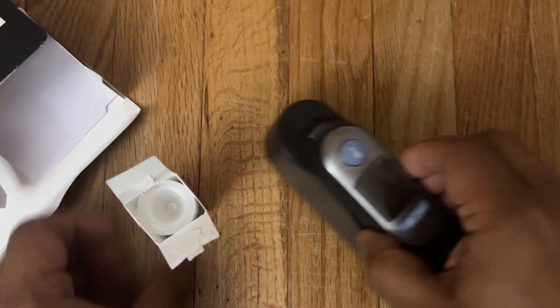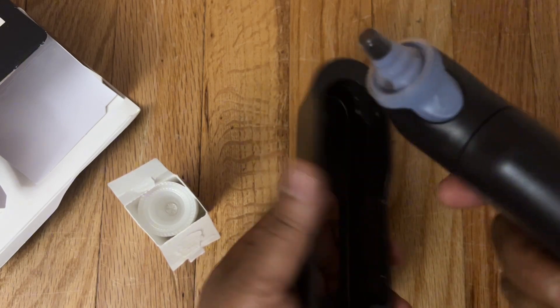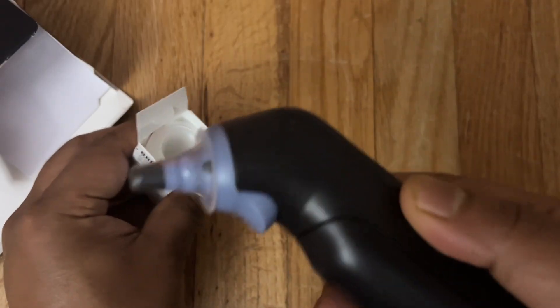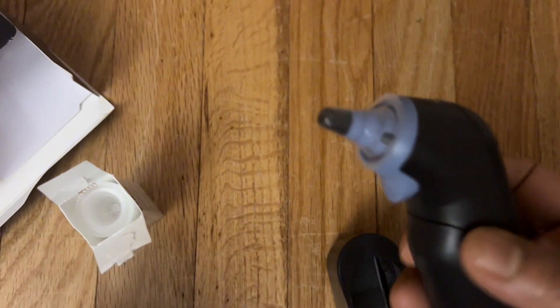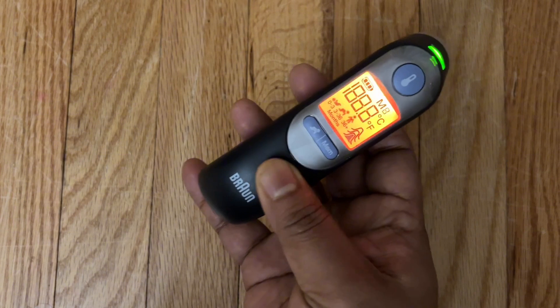This Thermoscan 7 ear thermometer is a new precision age-adjustable fever guidance for the entire family. It can be used for 0-3, 3-36, or 36 month plus, and can also be used for adults. It has professional technology that ensures accuracy every time.